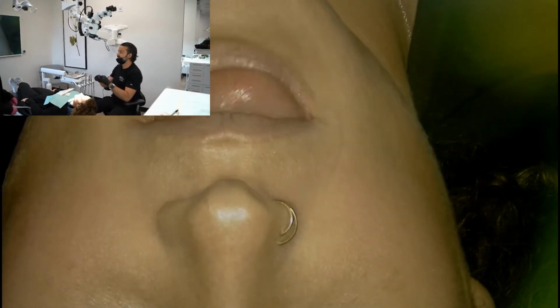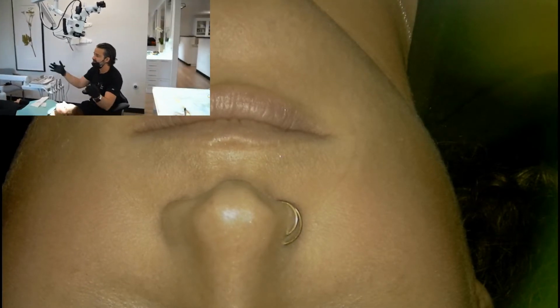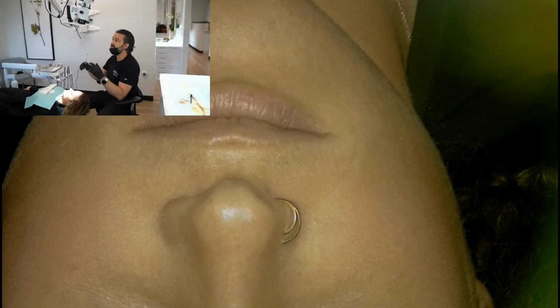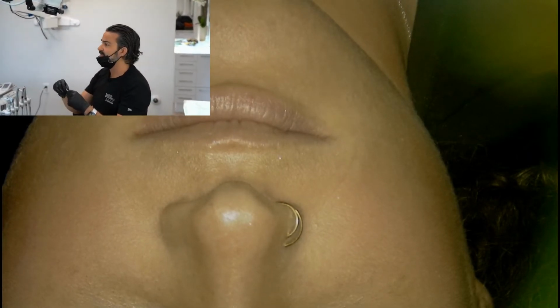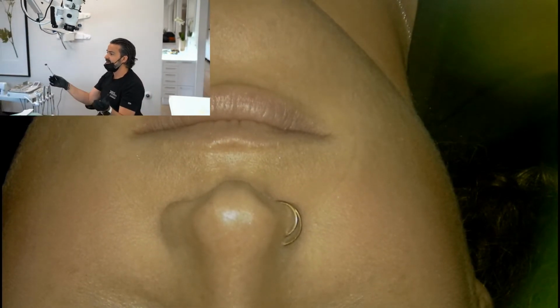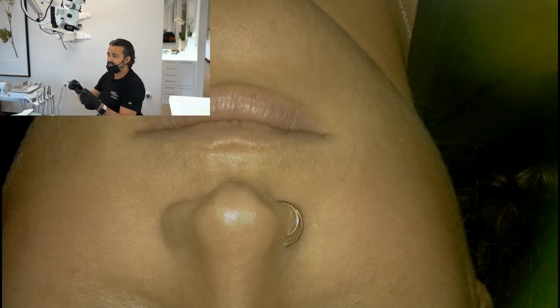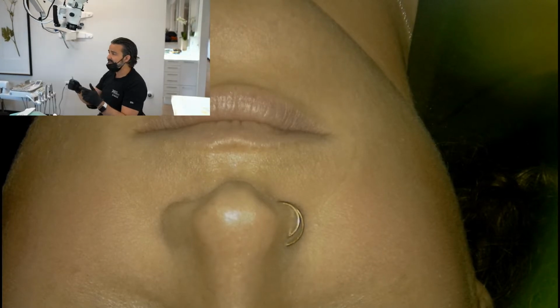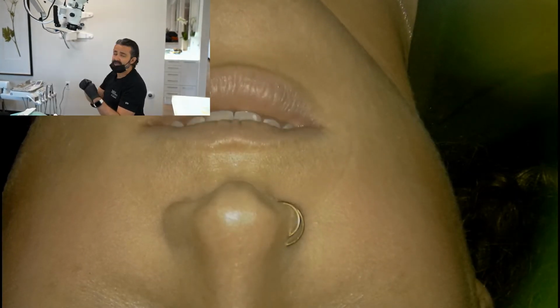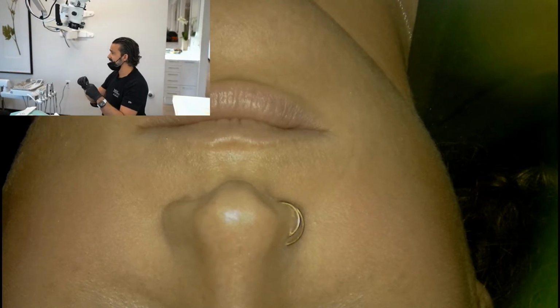I guess to review, when you go back to the ability to have an environment that you find comfortable, it's just like when you build a home, you really need to spend time in your environment and identify, I would say first, how your assistants work around the chair and how you work around the chair. And once you identify that, you pick the scope mount that makes the most sense.